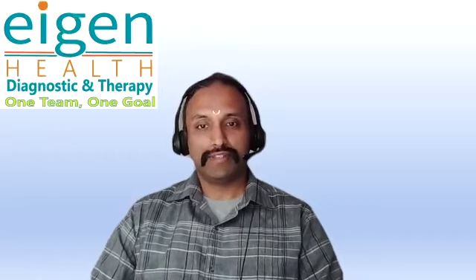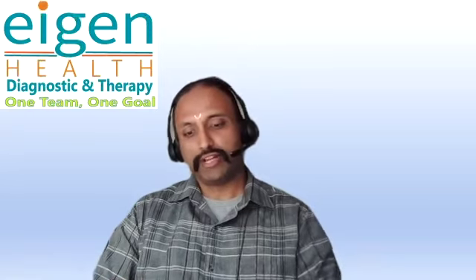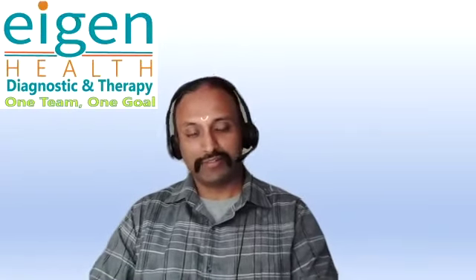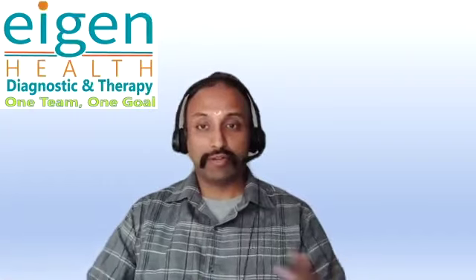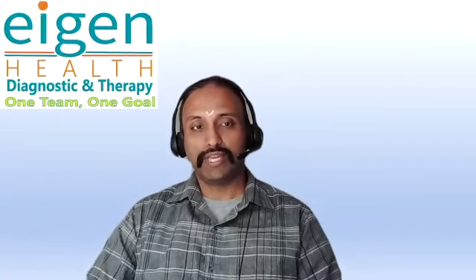As an engineer, the biggest thing you need to understand, or what I understood basically, is that machine learning is not for everything. You can't just say, I want to go from point A to point B, I'm going to build a machine learning system. Given the amount of effort it takes to build that, you know what, I'll just do standard software engineering and figure out how I can resolve the problem. That should be good enough. The biggest case in point for me is the segmentation problem. So we have segmentations for doing the prostate in both MRI and ultrasound.